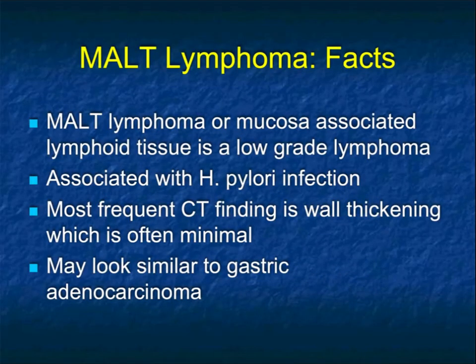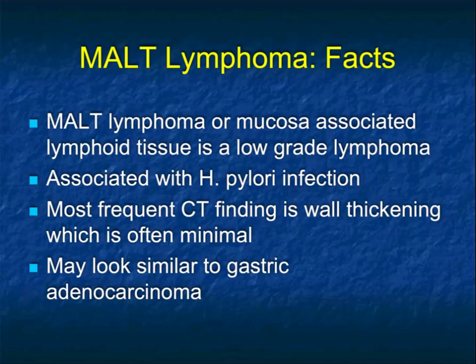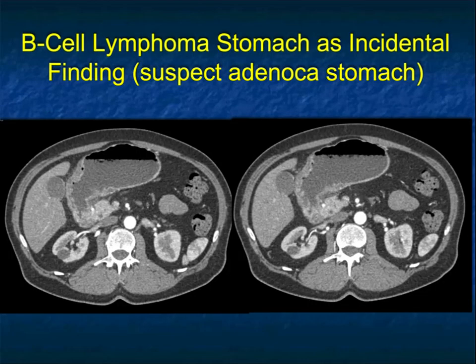MALT lymphoma — mucosa-associated lymphoid tissue — is a low-grade lymphoma commonly associated with H. pylori infection, very much like adenocarcinoma. The most frequent CT finding is wall thickening, but not bulky wall thickening. These are the ones that are particularly common to look very much like gastric adenocarcinoma.